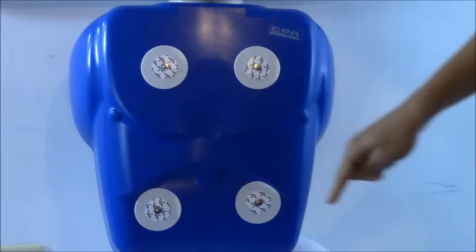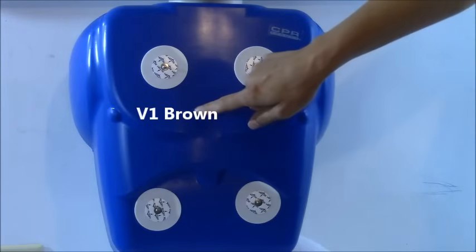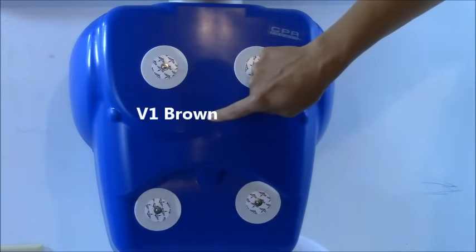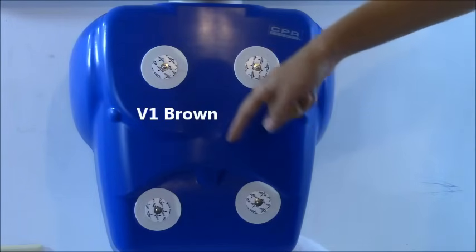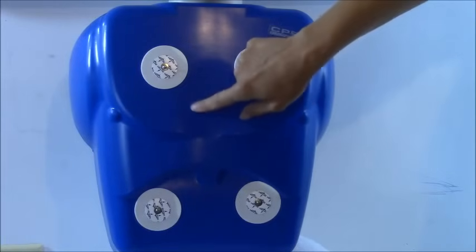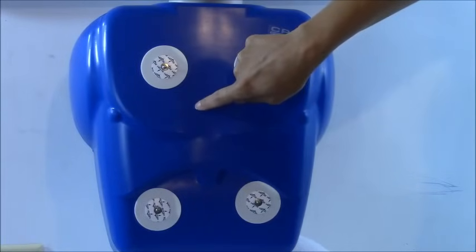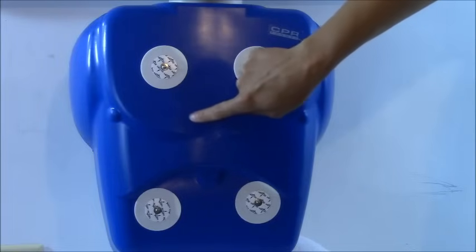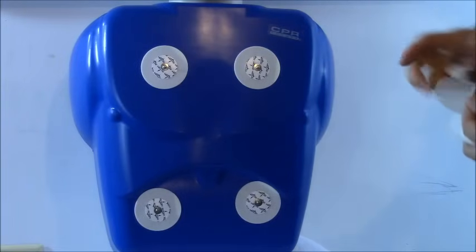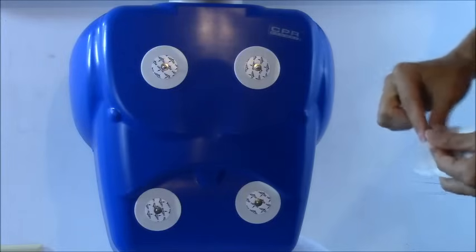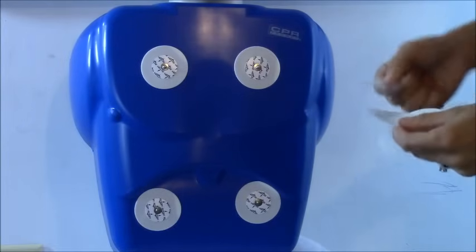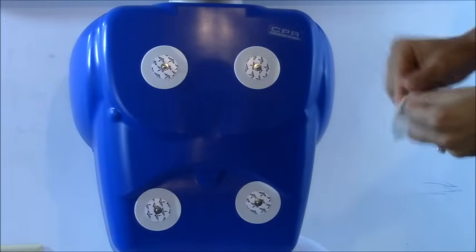And we have one more left. And this will be V1. V1 is the brown lead, and everyone just tries to remember this as chocolate in the middle. So the brown lead will be at the fourth intercostal space, which will be right in this area. Clean your area, prep it, and then put your electrode on.